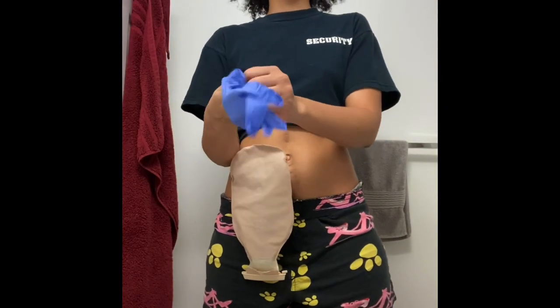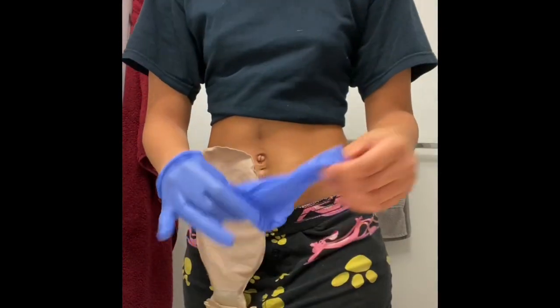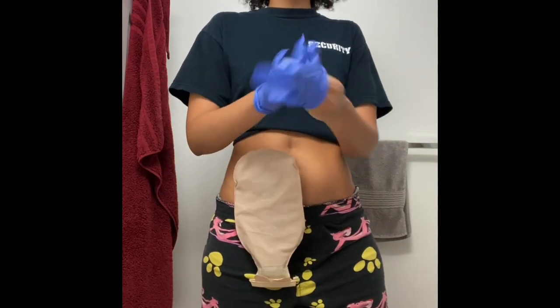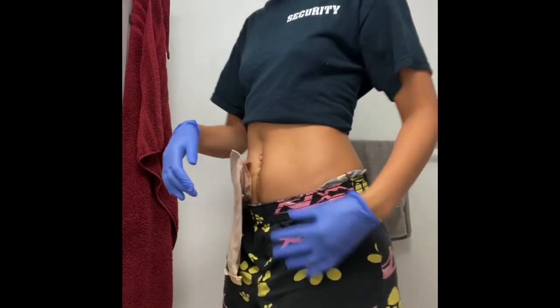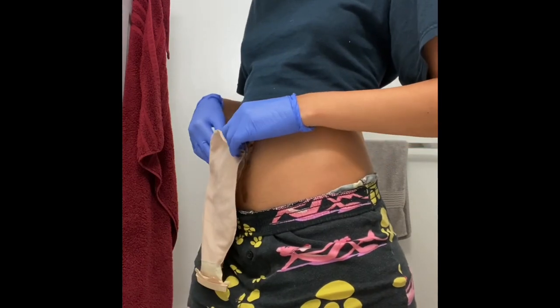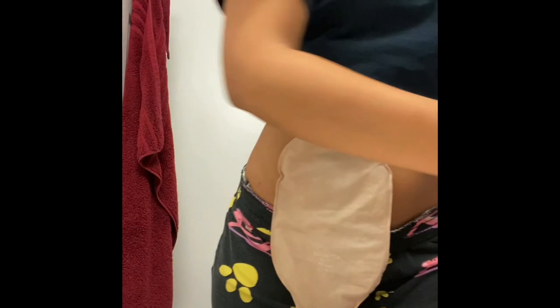Hey everyone, welcome back! I'm so excited today — I'm going to be administering my first bag change on the channel. I'm excited to have you guys see what that looks like for me and what it entails. As you can see, my bag is sort of lifting up. It is wet because I just got out of the shower, so I am about to change it and clean that up for you.